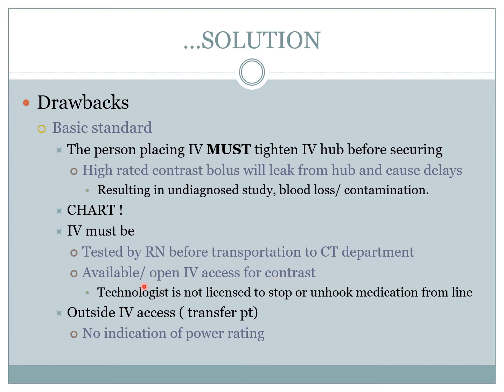And this is also a problem here. When the patient is in their room or on their floor in their ward, the patient needs to be transported to CT because CT cannot be transported to the patient.